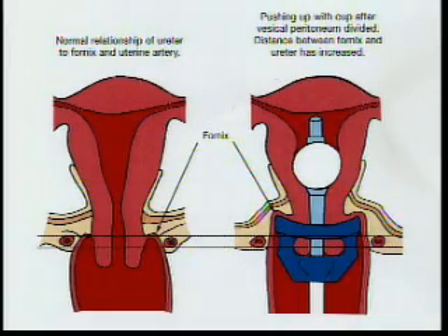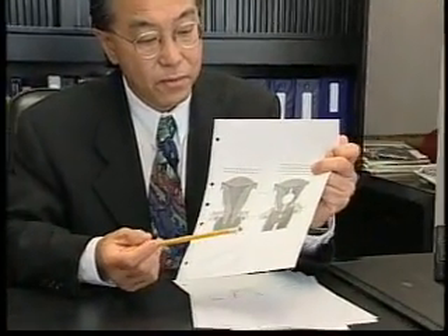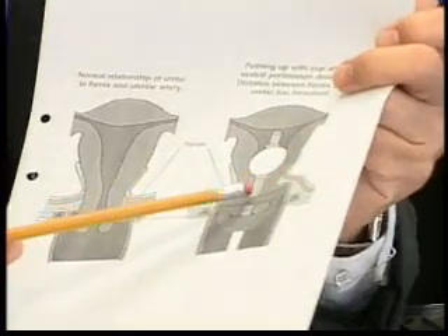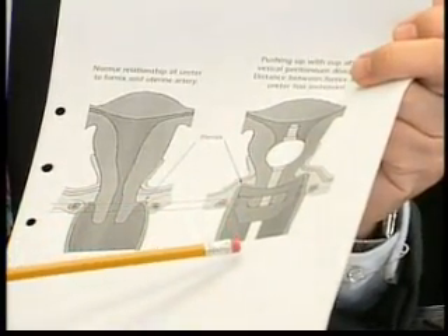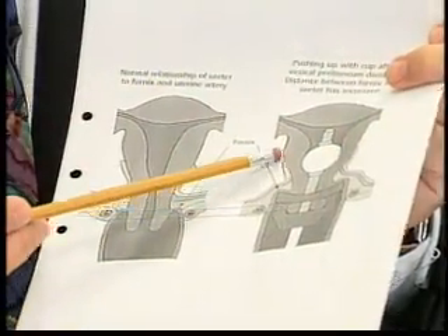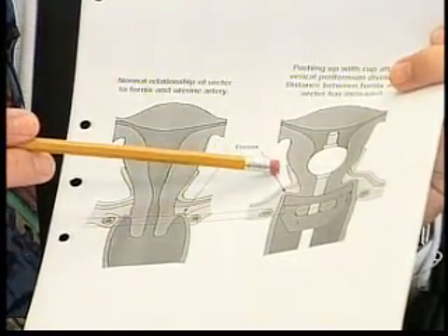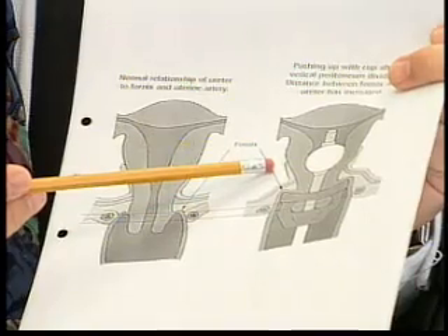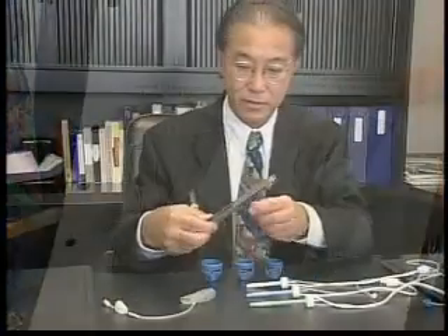When the colpotomizer is introduced into the fornix together with the roomy uterine manipulator and the assembly is pushed high into the abdomen, there is a lengthening of the vaginal fornix. This in turn elevates the uterine artery. In effect, this distances the uterine artery from the ureter, enabling its desiccation or tying at a safe distance from the ureter.